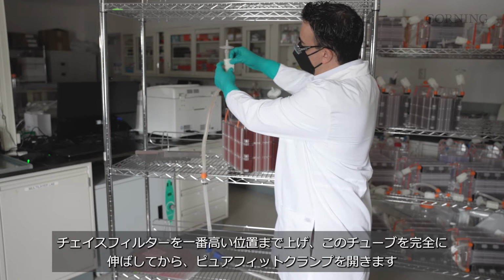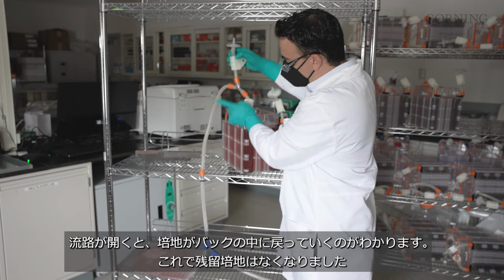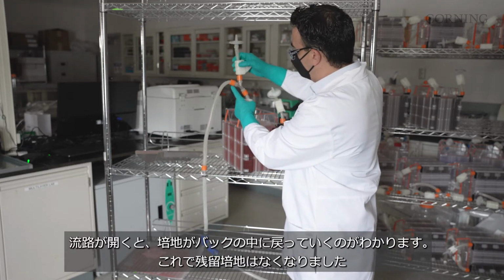before we open the PureFit clamp. So we open the clamp, and just like I mentioned before, physically inspect and de-pinch that clamp. As we de-pinch, you see the media that was chased back into the bag. And so that's cleared our line of any residual media.